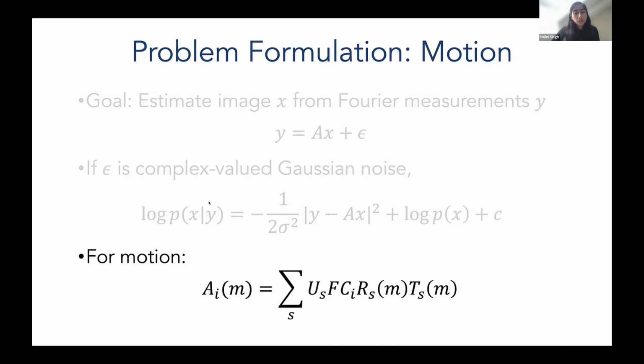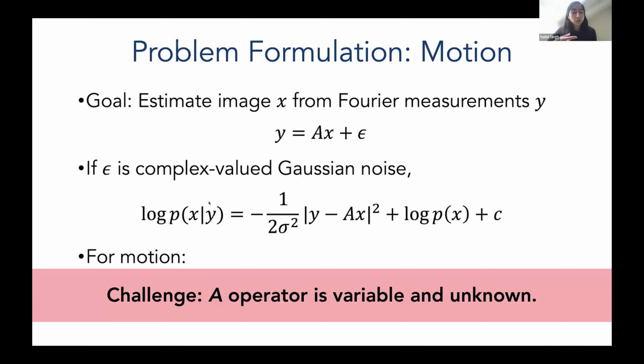And as I mentioned earlier, the really challenging part about this problem is that these motion parameters, which form the rotation and the translation matrix, are unknown in general. So while you could incorporate a device to measure these, we're going to focus on the really challenging but standard case where we don't have any information about what these parameters are. And this is challenging for two reasons. First, it's unknown, as we described. So from one example to the next, we don't know what the motion parameters are.